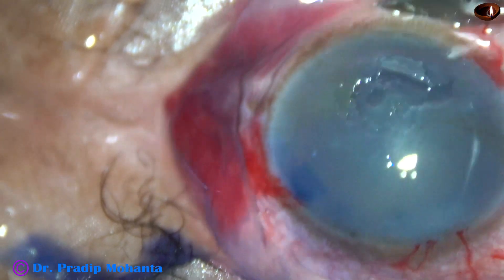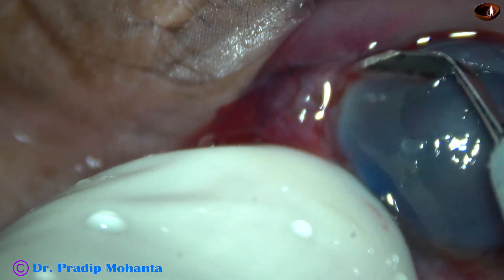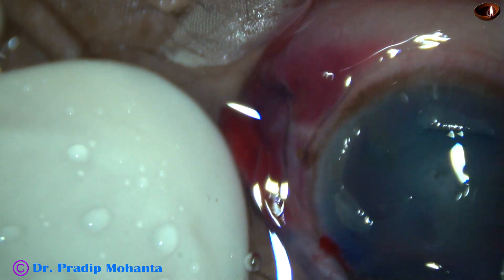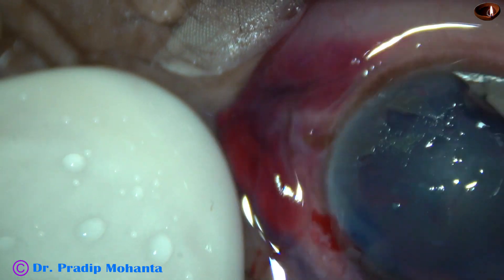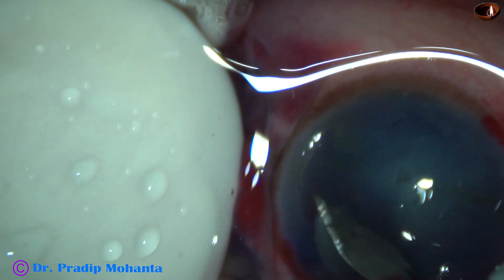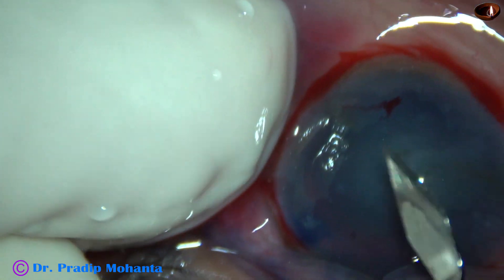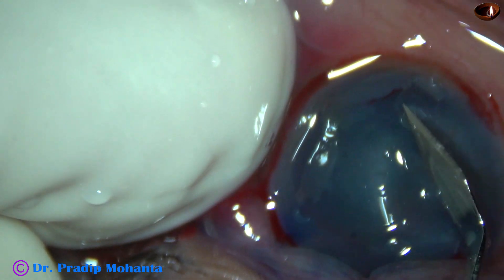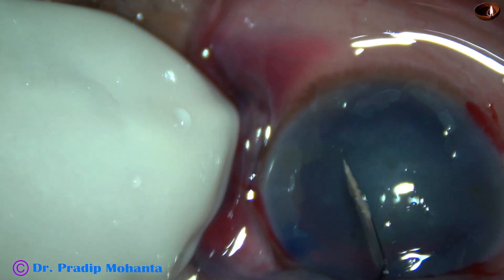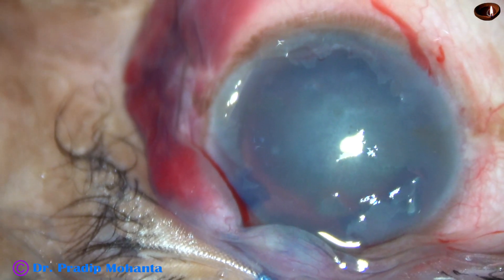This is a nice plane. There is some brownish pigment-like thing here which we see in band-shaped keratopathy, so there is an area like that in this case. The corneal epithelium and anterior stroma is very hazy. However, as I removed the epithelium, the visibility has increased to some extent. I have already asked for a bandage contact lens, which I am going to apply at the conclusion of surgery.